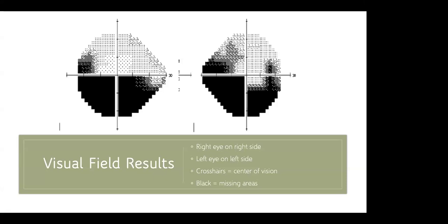Dr. Walton, there is a question now. The question reads, I work with multiple doctors and some like the fovea on for this test and others want it off. What do you prefer?